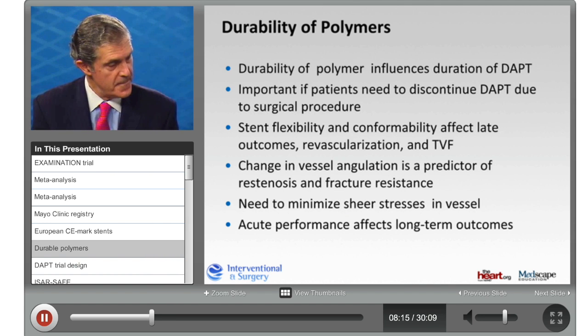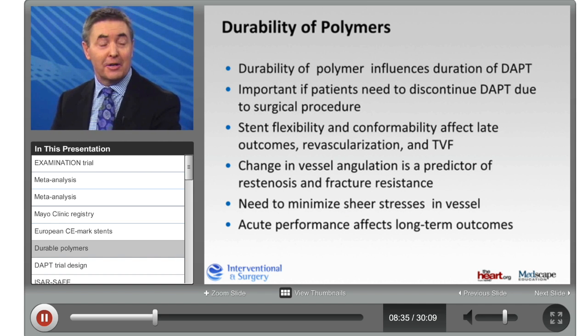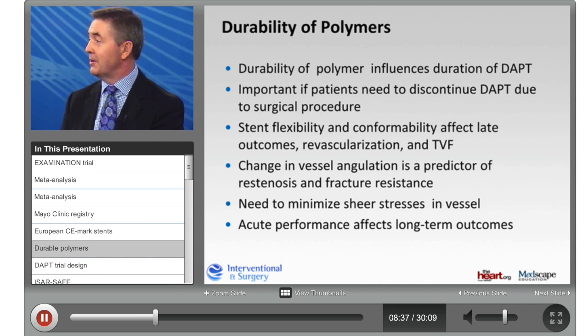I agree. And the other thing about the polymer loads is the degradation of a polymer is actually an exothermic reaction. So you actually have to generate some heat and acid and cations. So you want something to disappear quite quickly with the least inflammatory reaction associated with the degradation of that polymer. So not all abluminal bioerodible polymers are necessarily desirable.